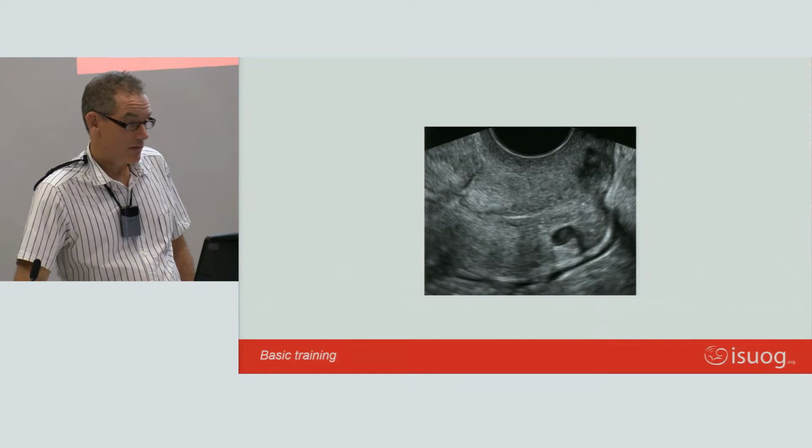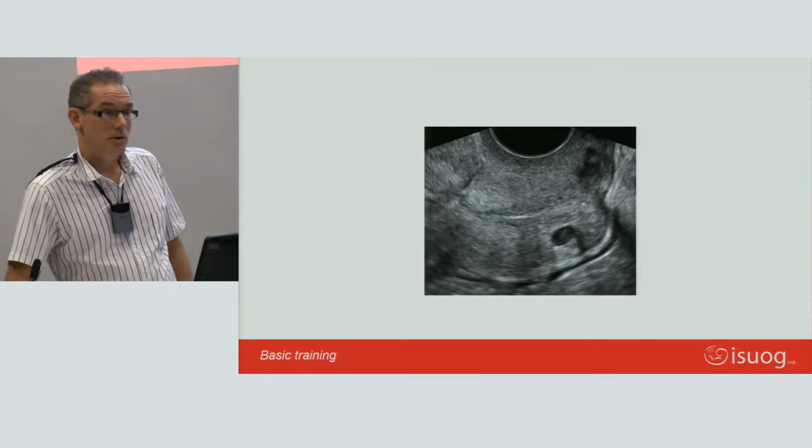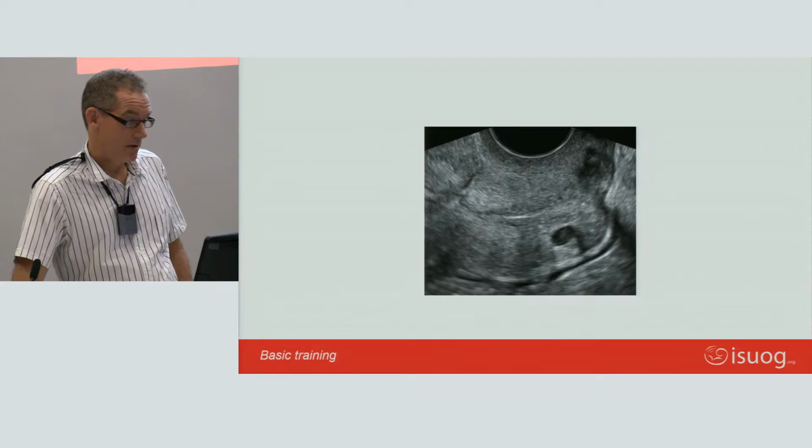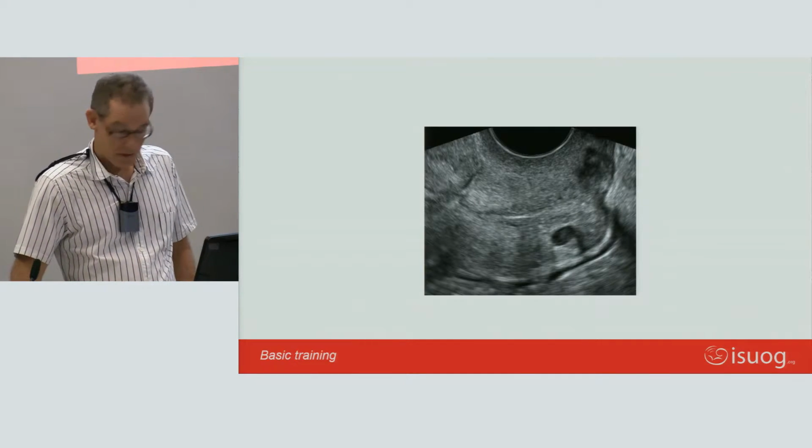It's very important that you follow this canal upwards, because that's the only way you can ensure that the endometrium that you think you're looking at is actually the endometrium. It's also common to see Nabothian follicles in the cervix, and that's of no worry.